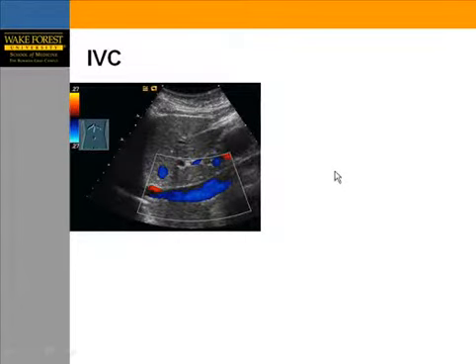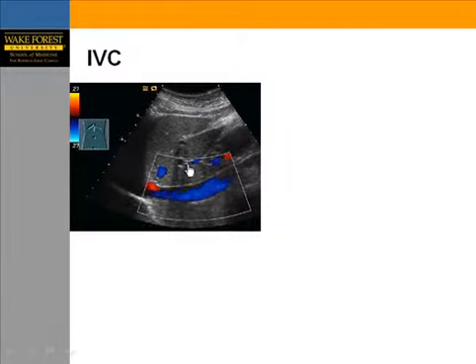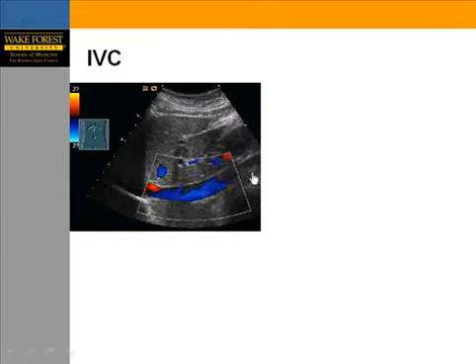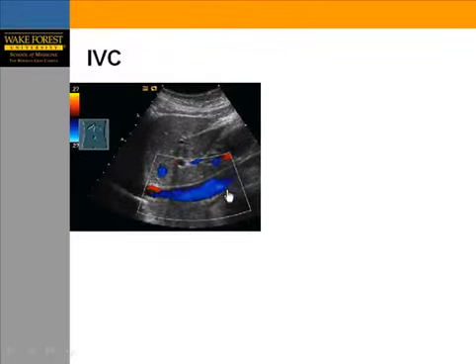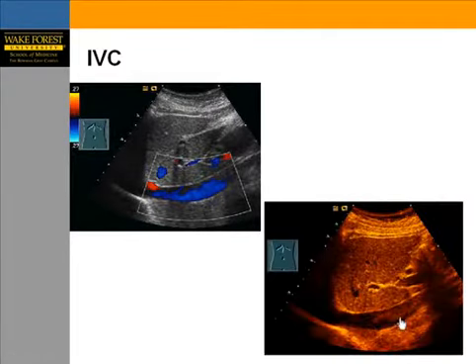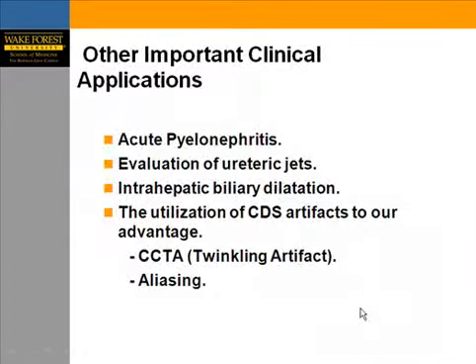Another example is the IVC. You can be misled if you start with color Doppler — color override can cause you to miss the diagnosis of thrombosis. Look at this slide: color Doppler nicely fills the lumen, and from a still image alone you would say everything is fine. But the grayscale shows echogenic material within the IVC, consistent with a clot that you can easily miss if you overwrite it with color Doppler.